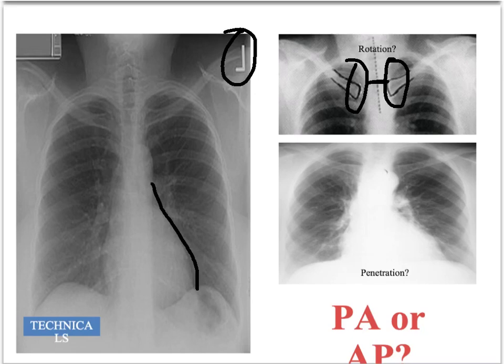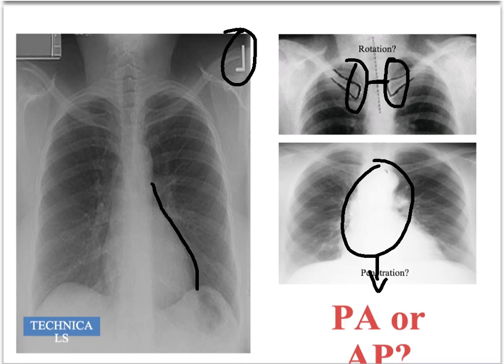Next, consider how well penetrated the X-ray is — is it under- or over-penetrated? If it is under-penetrated, you won't be able to see the vertebral bodies, which you should be able to see all the way through the heart. On this example you cannot see them through this area at all, so it is probably a little under-penetrated. If over-penetrated, you could see further down as well.